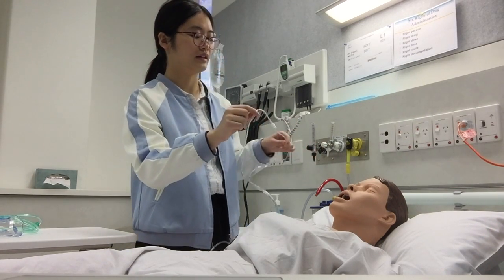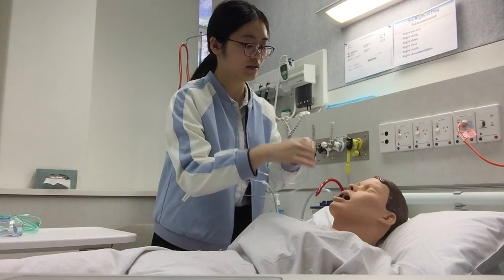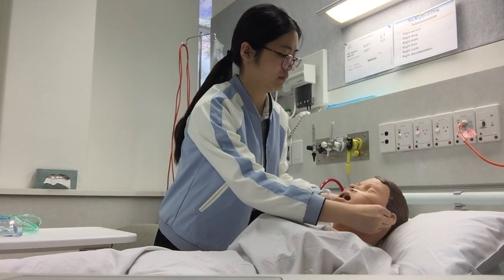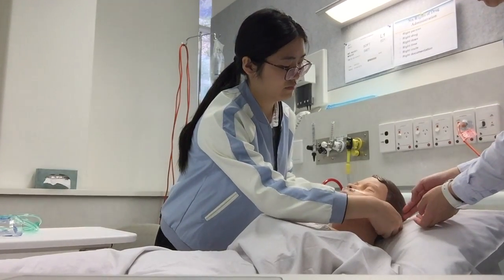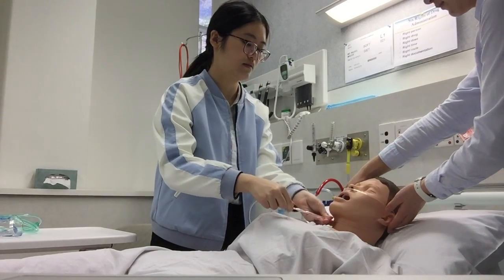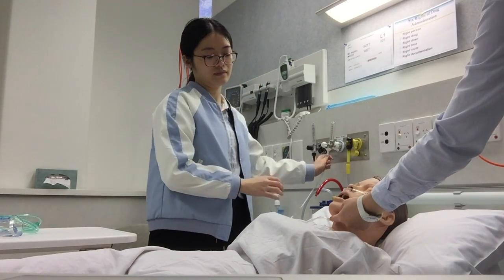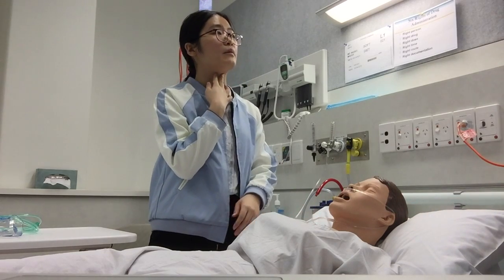When we connect the nasal cannula with the patient, we usually put the small tube over the patient's ears, and we connect with the oxygen wall. What's that for? It's to make the tube more stable for the patient.